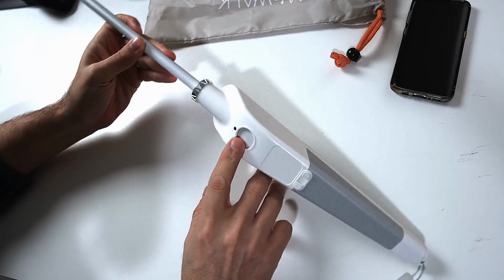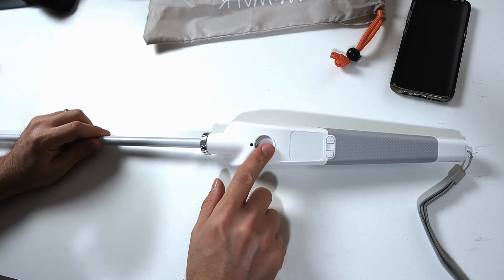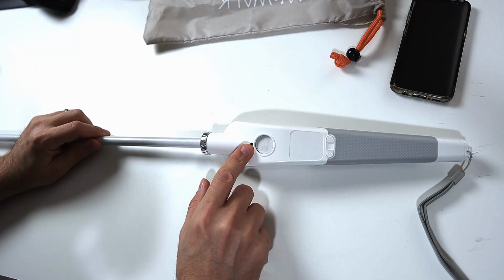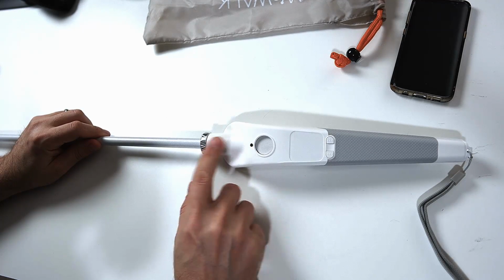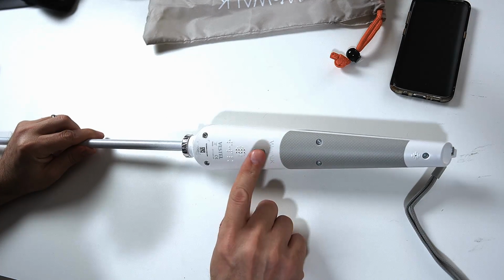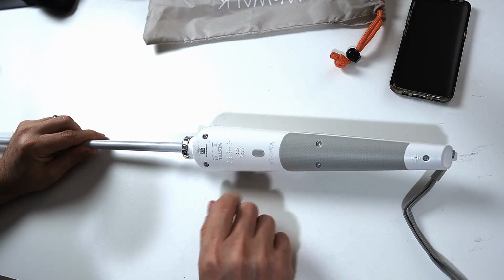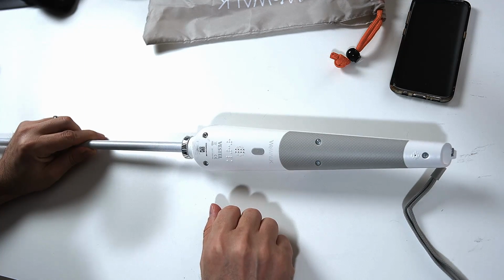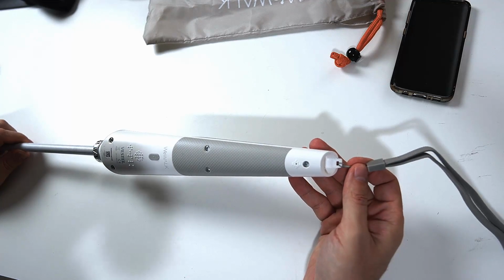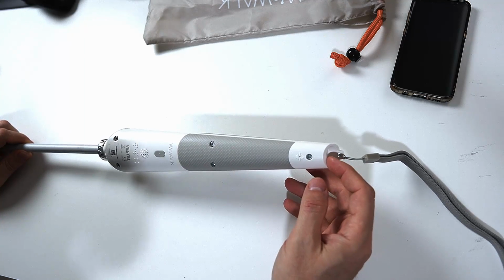Just ahead of that, you have this large sensor. This is how the cane detects obstacles in front of you. Just ahead of that, you have a little LED light. This can be turned on or turned off. Then on the very bottom, you have the power button. Long press turns the cane on, long press turns it back off again. Down here at the handle, you have where the wrist strap attaches, and just underneath that is the charging port.